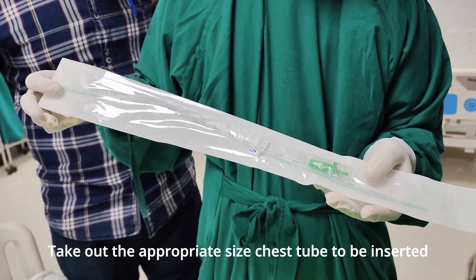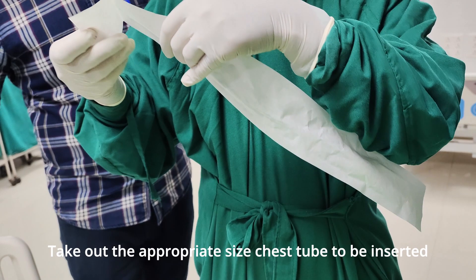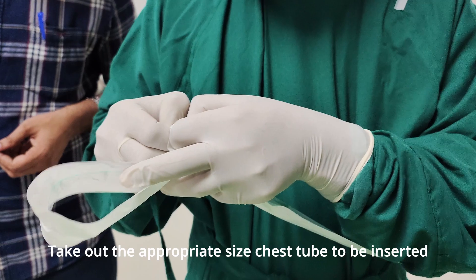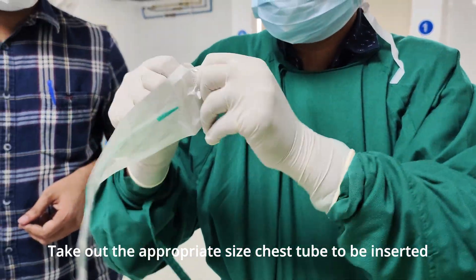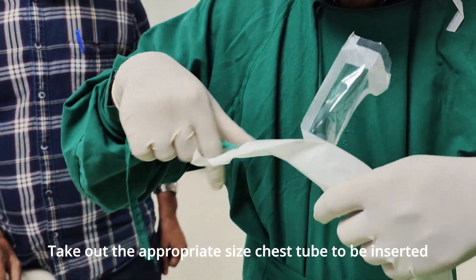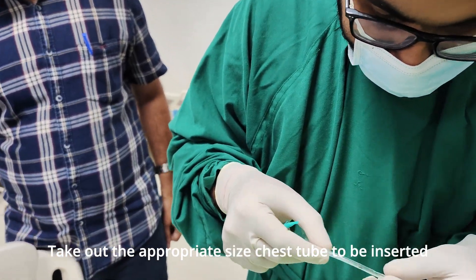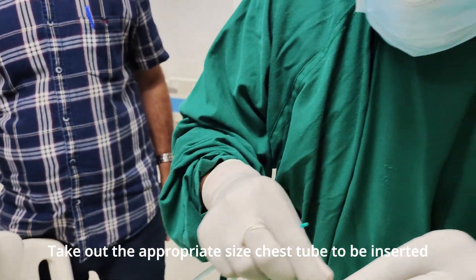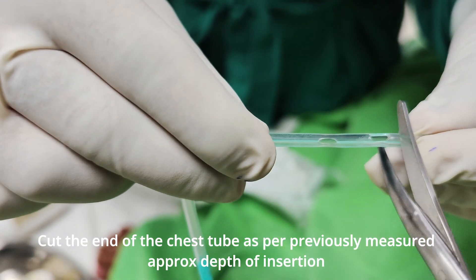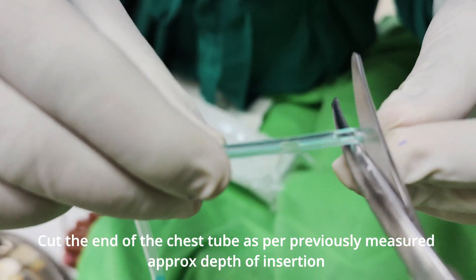Take out the appropriate size chest tube to be inserted. Cut the end of the chest tube as per the previously measured approximate depth of insertion.